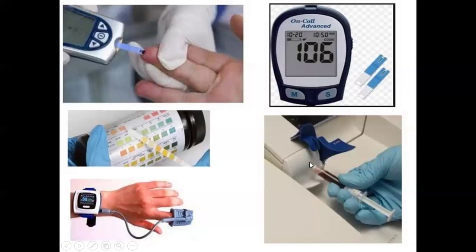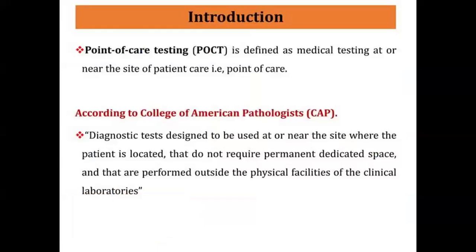And this is a laboratory based point of care device where you put blood in a syringe into the machine and a lot of things can be analyzed at a particular point, like cholesterol concentration, what the creatinine level is, the WBC, RBC count. Like this you can get varied levels of readings at one particular time. So this is very good for our medical testing, and you can even have these point of care testing devices at your home.